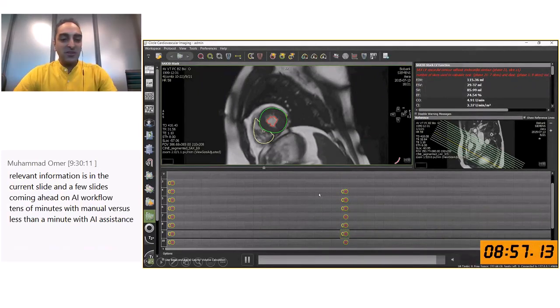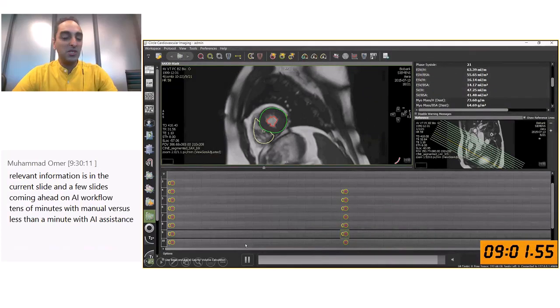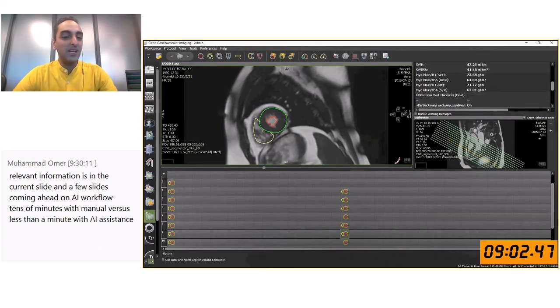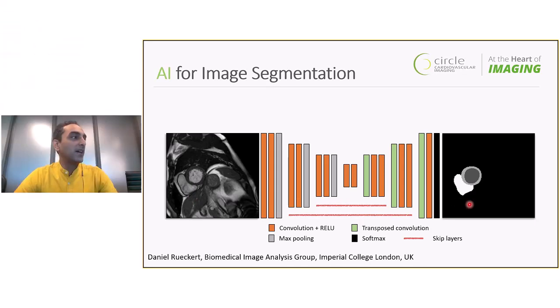So one easy way for us to simplify this workflow is to use machine learning to automatically detect these contours that the clinicians have to draw manually. And to do this, we can use the UNet architecture again, except the inputs at this point will be the raw images, the raw MR acquisitions, and the outputs are trained to be different label masks.